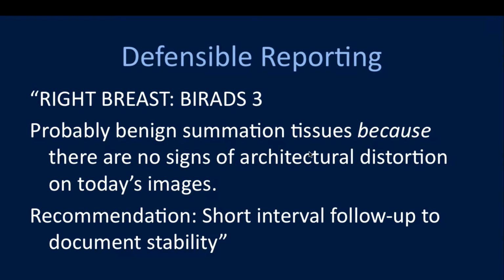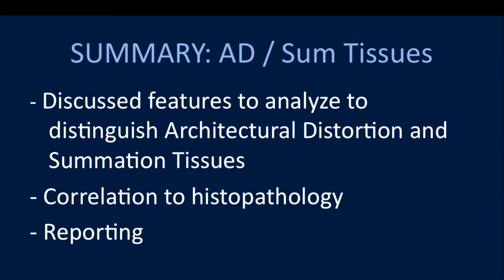And that is a defensible report. It may be wrong. It may turn out to be cancer in 6 months or 12 months. But if it is based on what's reasonable, and you can defend it and say, well, in these images, on the data that I have today, there were no straight lines in a spoke wheel fashion, that's defensible. And so that's my point.